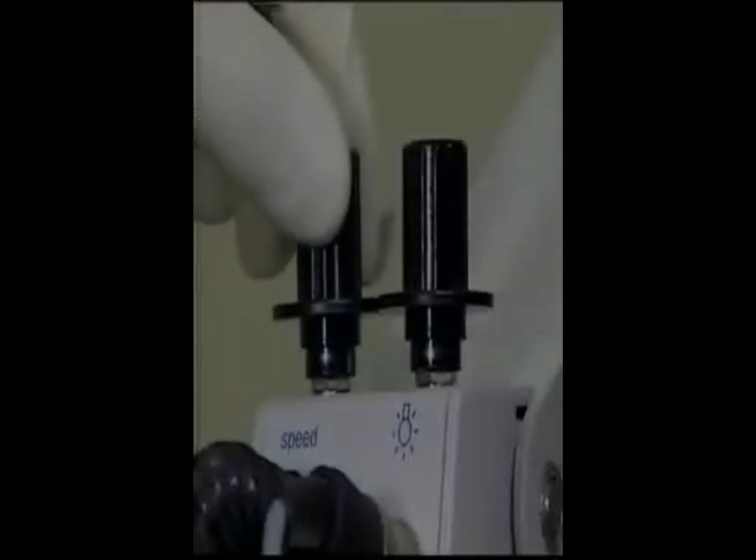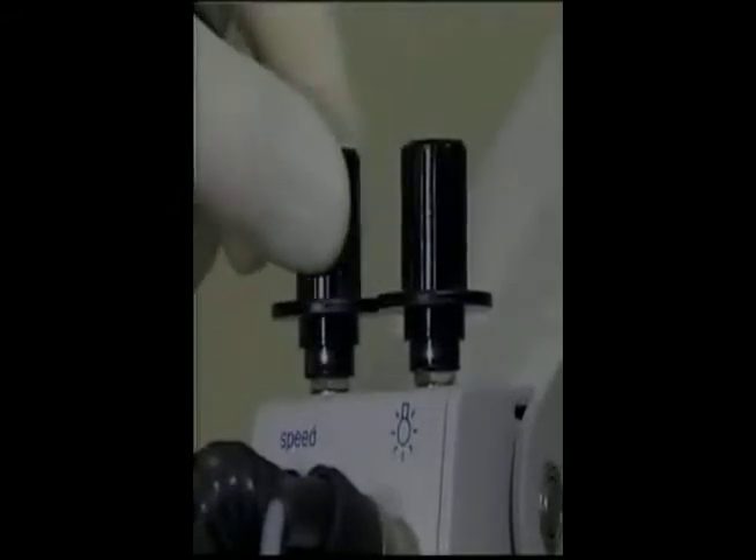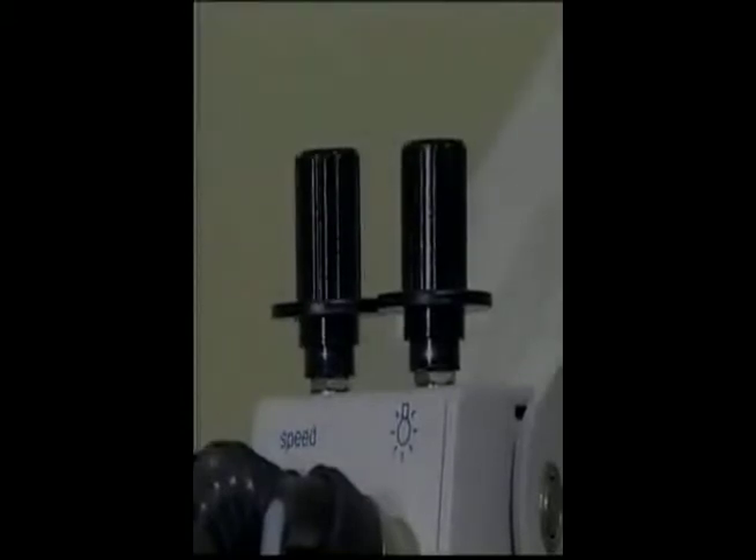Also, the speed at which the microscope responds through the various user-controlled focus adjustments can be set to meet your individual preferences — yet another feature that makes the Universa 300 so user-friendly.